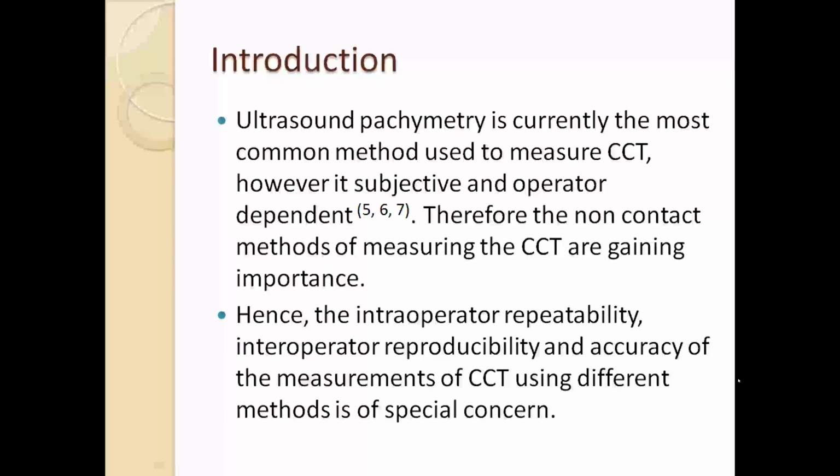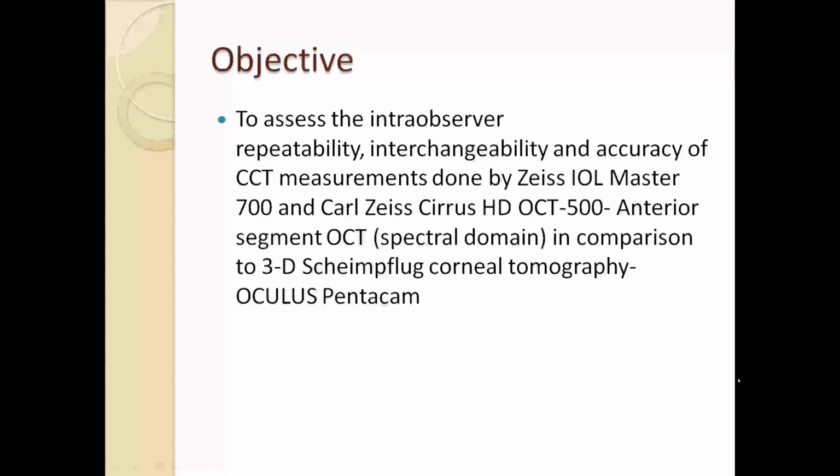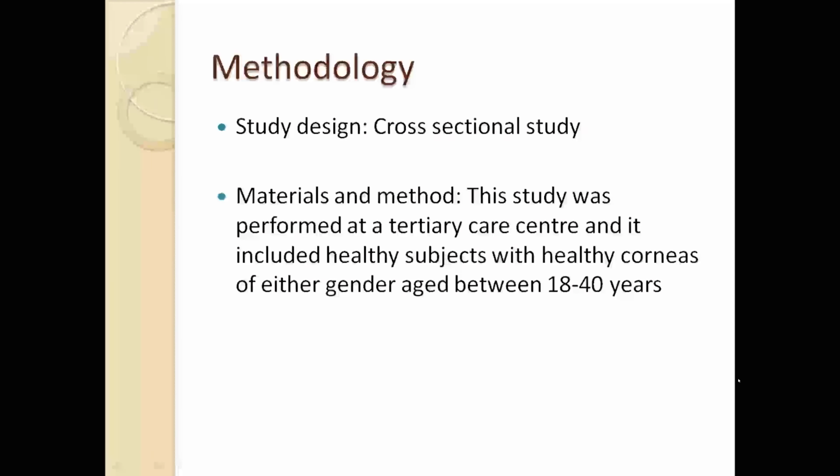Ultrasound pachymetry is currently the most common method used to measure central corneal thickness. However, it is subjective and operator dependent. Therefore, the non-contact methods of measuring the CCT are gaining importance. Hence, the intra-operator repeatability, inter-operator reproducibility, and accuracy of the measurement of CCT using different methods is of special concern. The objective of the study is to assess the intra-observer repeatability, interchangeability, and accuracy of CCT measurements done by Zeiss IOLMaster 700 and Carl Zeiss Cirrus HD OCT 500 anterior segment OCT spectral domain in comparison to the 3D Scheimpflug corneal tomography Oculus Pentacam.